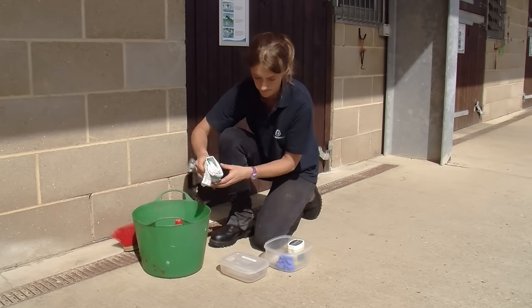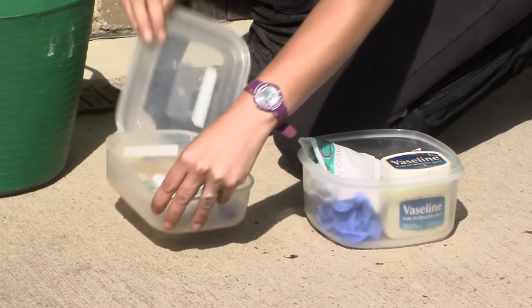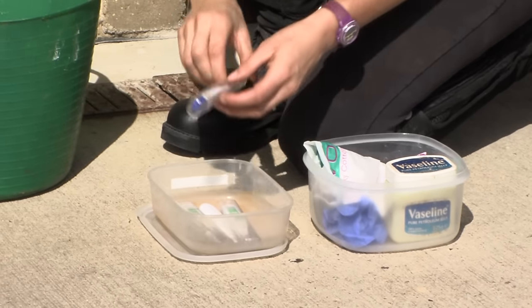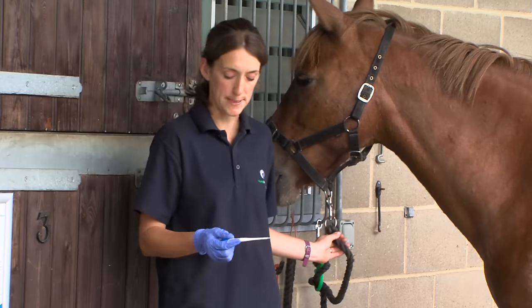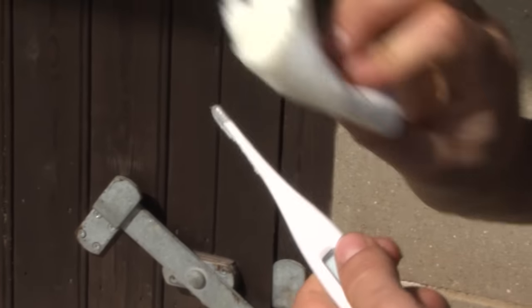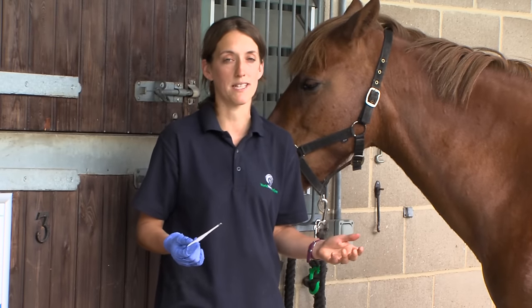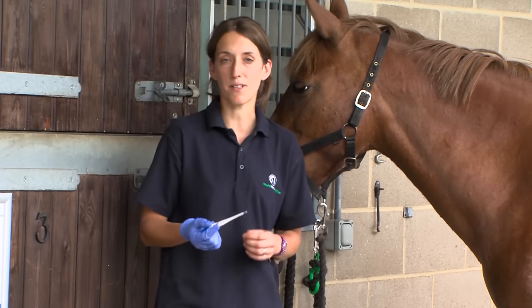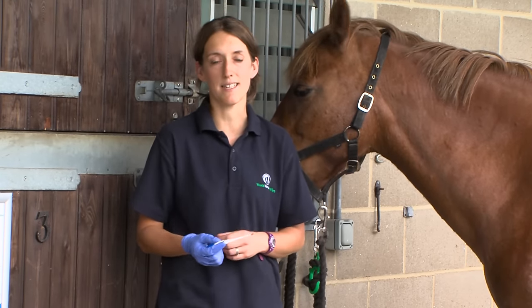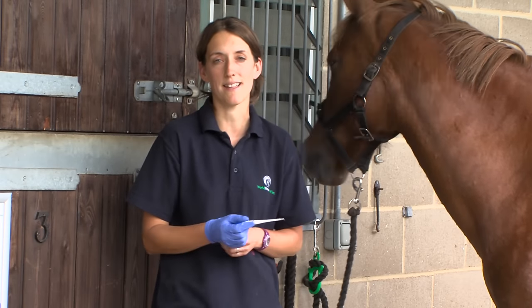It's really useful to get all of your equipment together before you start. Today I'm using a digital thermometer — you might have a mercury thermometer at home, that's fine. I'm going to lubricate the end of the thermometer with a water-based lubricant. I've chosen to wear one glove today, you might choose to wear two, and I've also got an antibacterial cleanser handy for the end of the process when I'm going to clean the thermometer and my hands as well.